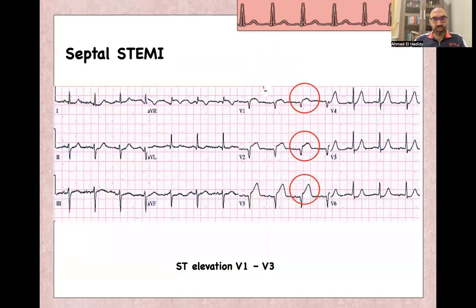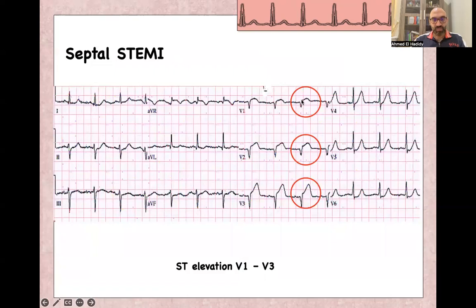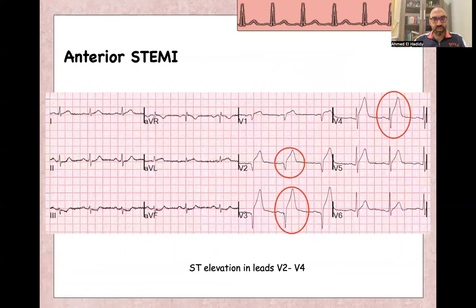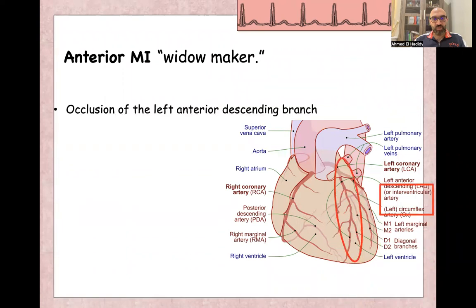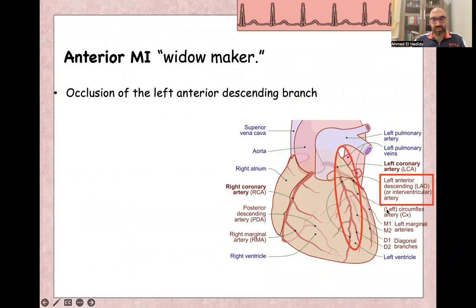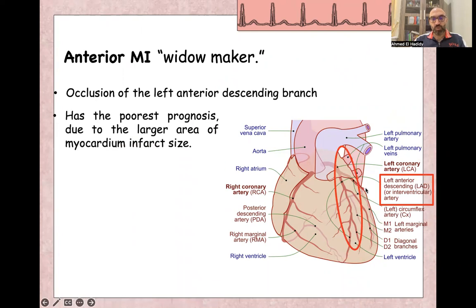Here there is ST elevation of more than one small square and more than 0.15 millivolts in leads V2 and V3, and slight elevation in V1 — this is septal myocardial infarction. For anterior STEMI, there is ST elevation and Q-waves in leads V2, V3, and ST elevation in V4. Anterior myocardial infarction, called the widow maker, appears due to occlusion of the left anterior descending artery and has the worst prognosis among all myocardial infarctions due to the large area of infarction.